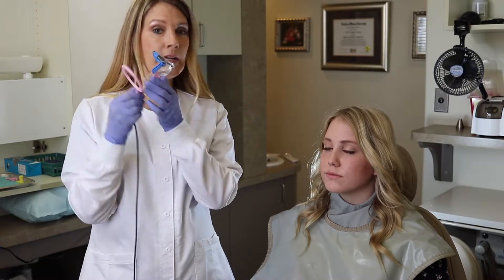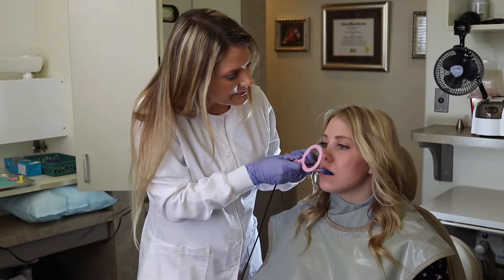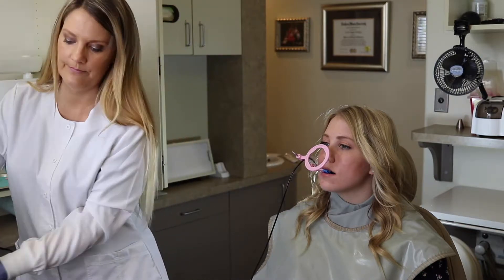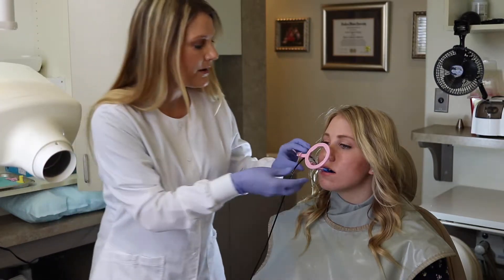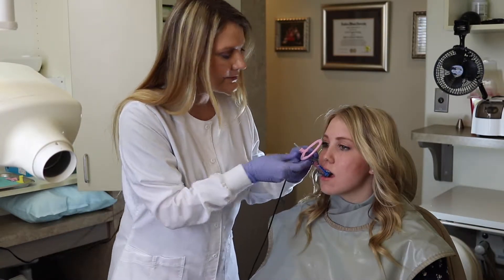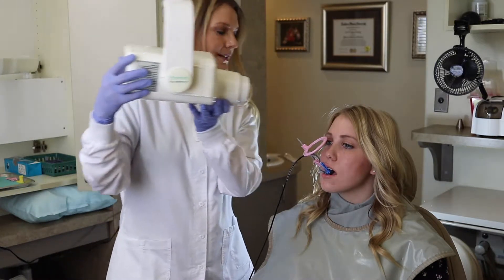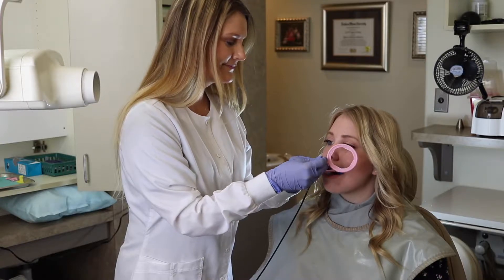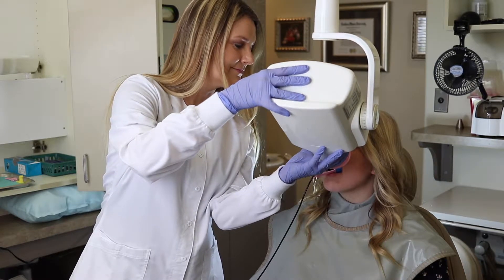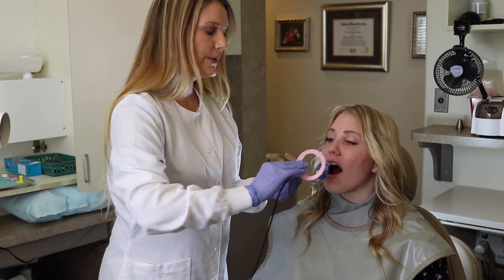You will position this where you'll take 1, 2, 3 and then 1, 2, 3 on your patient — open, bite down — one position, our second position, and our third. When you're done with your uppers, we're going to take this out.